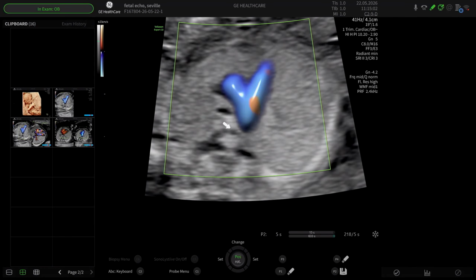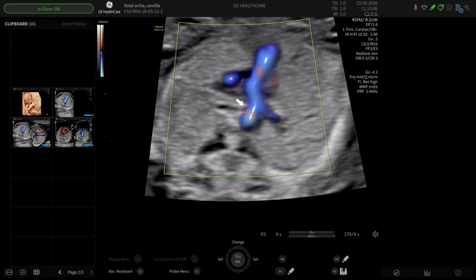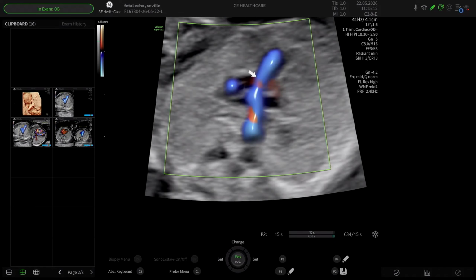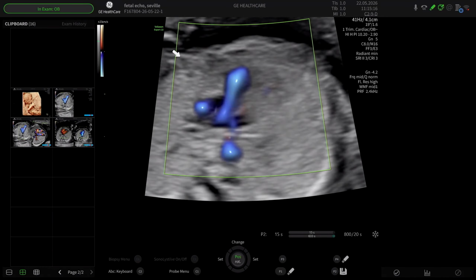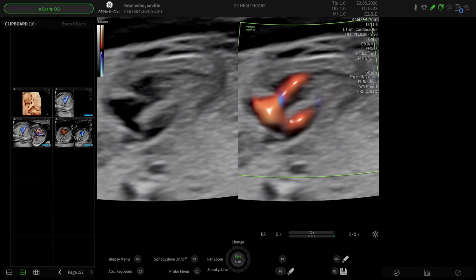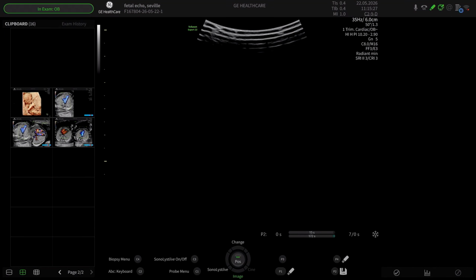But it tells you exactly the point where you are. This is the trachea, then you're down to right and left main bronchus. Here you have the transverse arch, vessel close to the trachea, transverse arch, pulmonary artery. When I'm looking in the first trimester of pregnancy, I'm looking to see that there's symmetry of the ventricles. I'm looking to see if there's normal movement across the valves, just to make sure there's no tricuspid valve regurgitation.